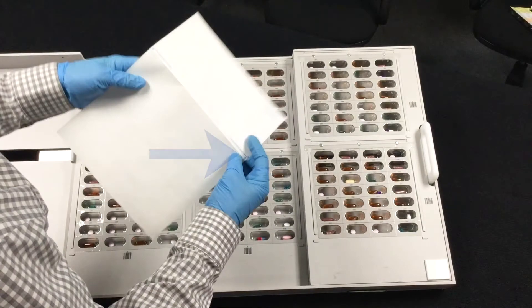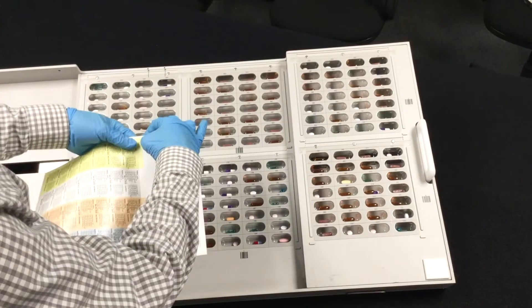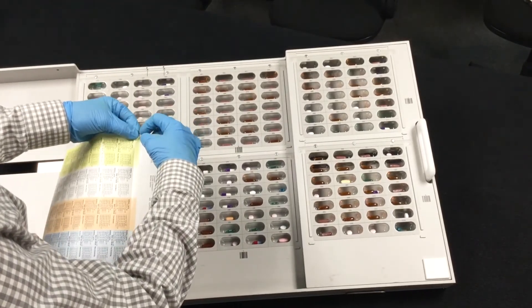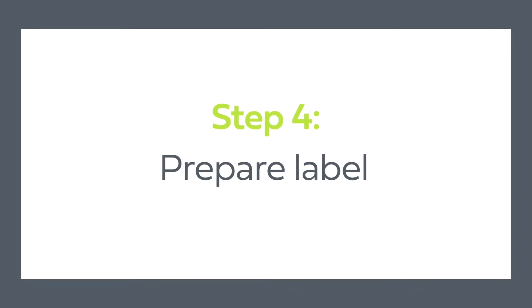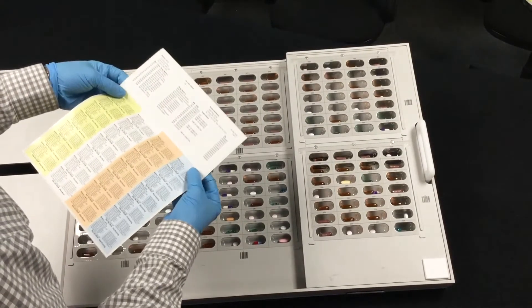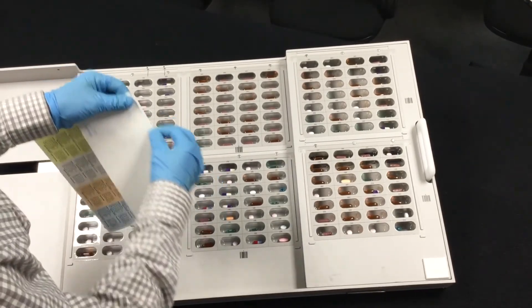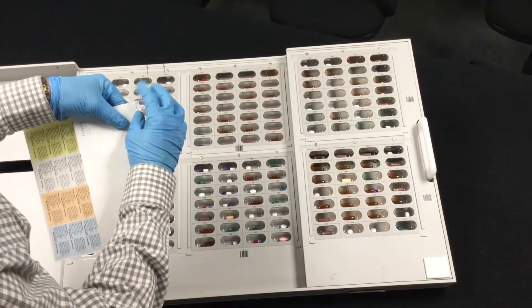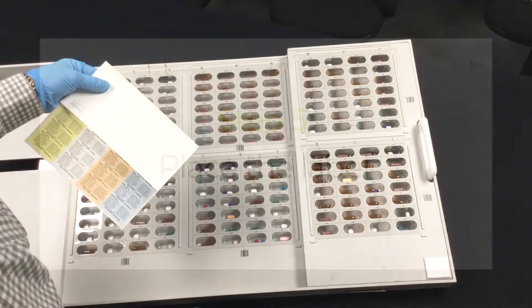Locate the edge ties indicated on the back of the label. Snap the edge ties on either side of the label. Locating the perforation at the back of the label, fold along this perforation so the top part of the label meets the bottom part of the label. Then, remove the strip on the back of the label where indicated to expose a line of adhesive.